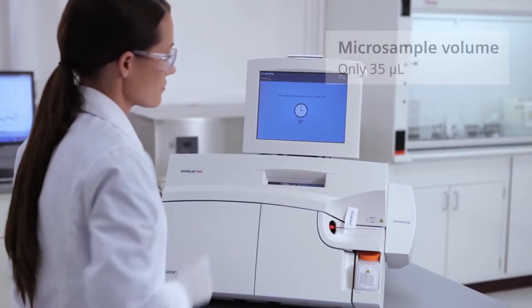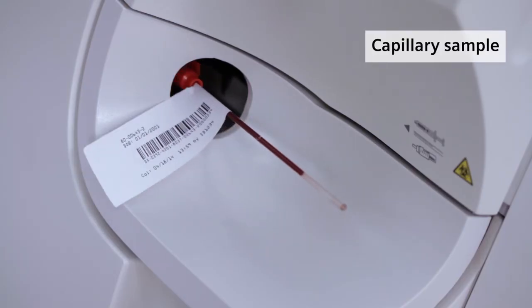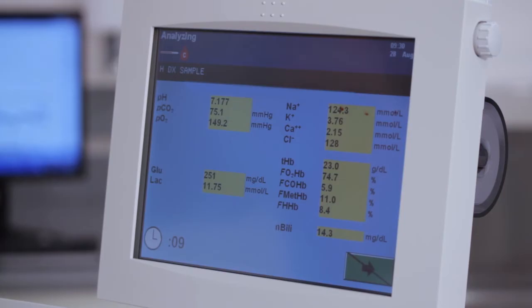The RapidLab 1200 system analyzes even the smallest of patient samples using capillary tubes. The automatic identification of a small blood sample instantly shifts the system into micro sample mode ideal for the NICU setting where whole blood volume is critical.